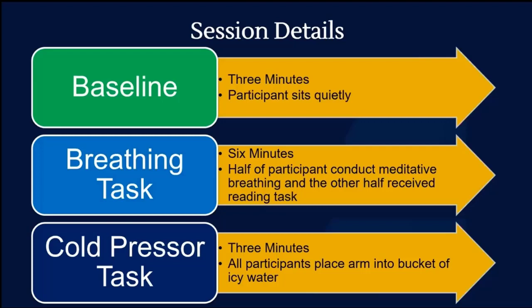If we're looking at certain metrics, such as impedance cardiography or anything to do with blood pressure, we certainly want to know when those postural shifts change and when they actually stand up. So having a note about that, and another baseline, perhaps a standing baseline, would help us a lot, because we don't want to use the sitting baseline to offset a standing portion. So multiple baselines are definitely welcome. And again, that could also be a recovery.